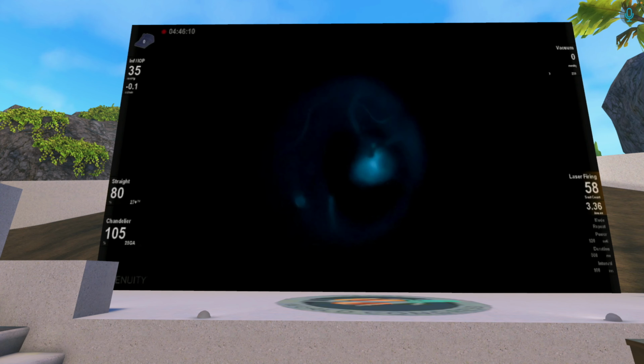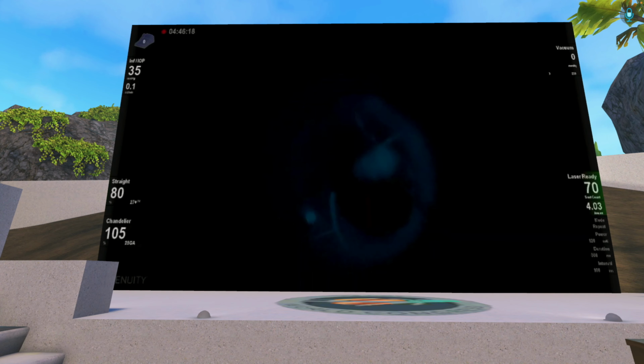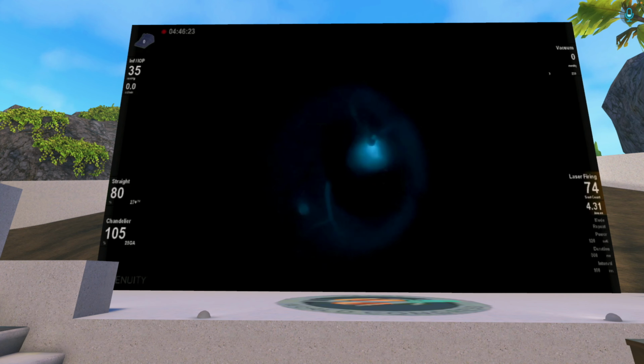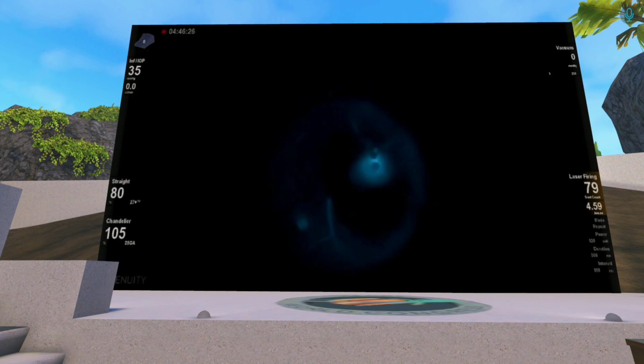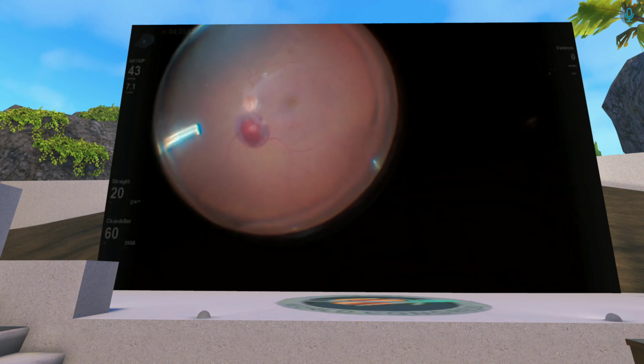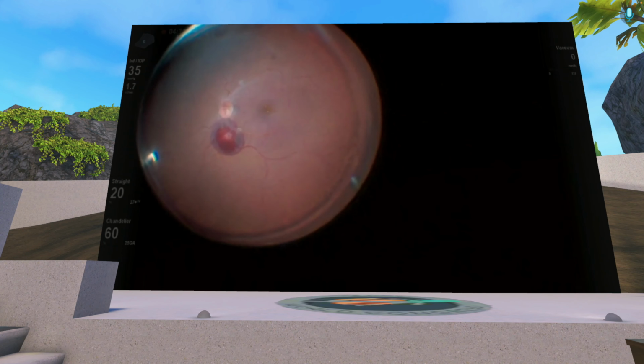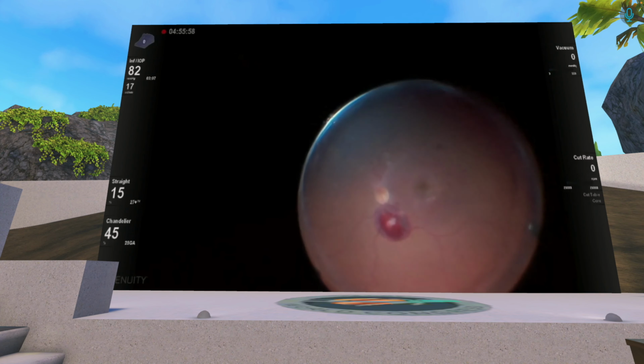This is a macroaneurysm, and here you can see it, especially when we're doing the laser, you get kind of a retroillumination, and you can see the extent of the full macroaneurysm. So this we treated a little more extensively.